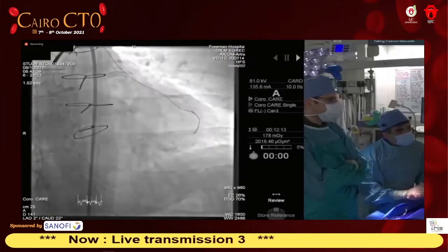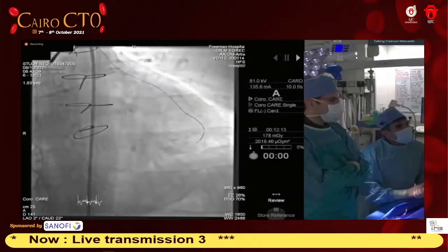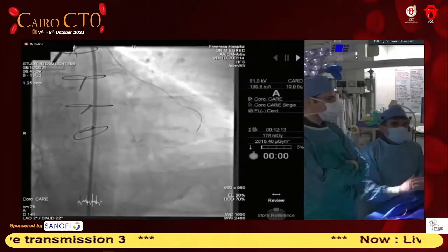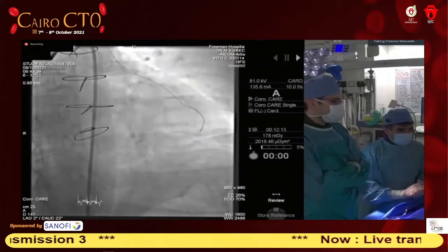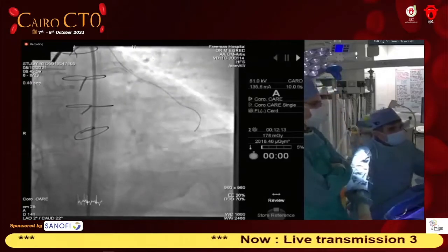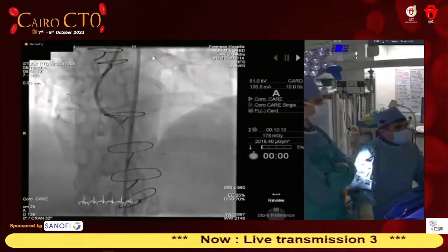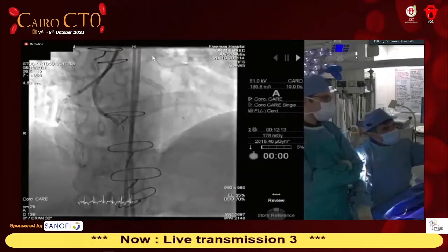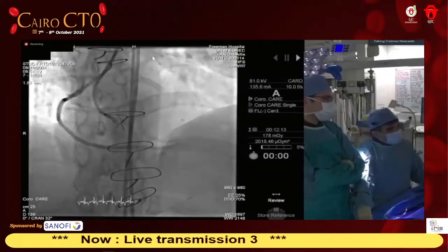You can see a tip injection from the microcatheter, and there is a very small connection, but it's difficult to know the anatomy. And I think it becomes really dangerous if you're not careful, particularly with the epicardial collaterals. Next one. So now we revert back to going through the vein graft to the LV branch, opening that and then assessing the PDA after that.